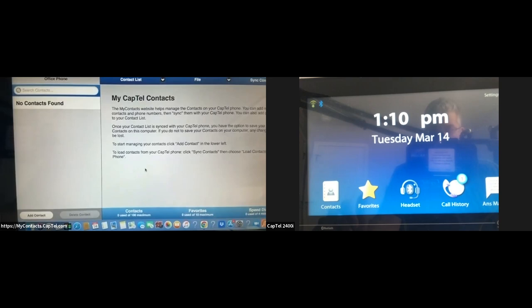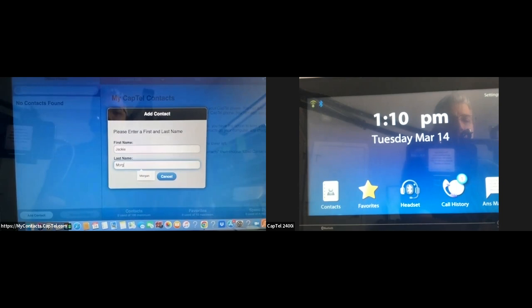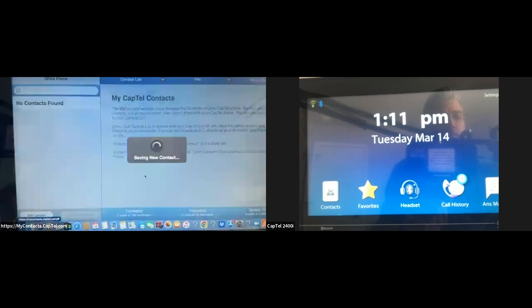We're already here at the website. I'm going to go down to where it says 'Add Contact.' I need to enter the first name of a person I want to add — I'll put Jackie, and then the last name, Morgan. You can use the Tab key to switch between different sections on your computer. Once I'm satisfied with the spelling, I hit Save. And there it is — Jackie's name is right here on the left-hand side.